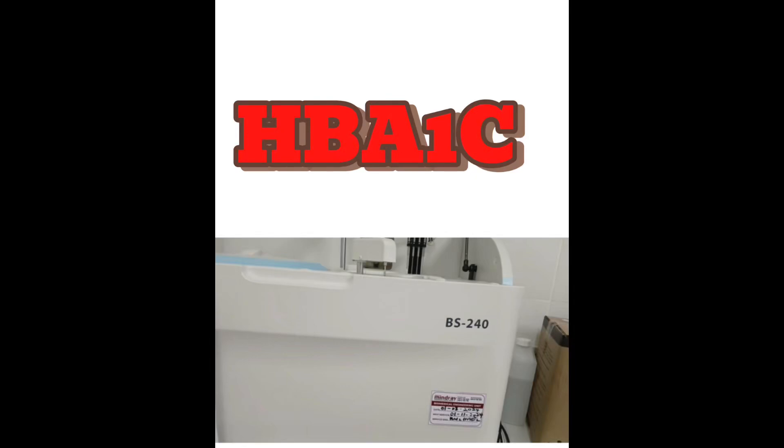Welcome. In this video we will learn how to measure HbA1c using the Mindray BS240.